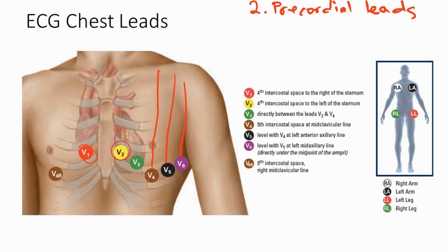But in pediatrics, very often, because kids have more of an RV dominance, and the right side is looked at more importantly because of its relevance compared to the adults, we also add a couple more leads. So usually there is a lead V3R right over here between V1 and V4R.